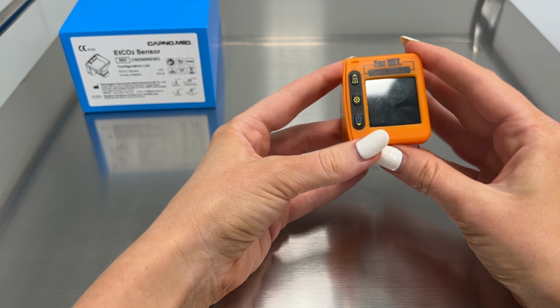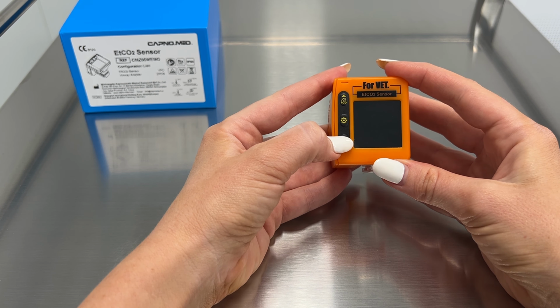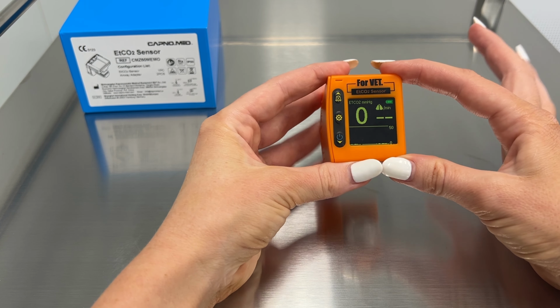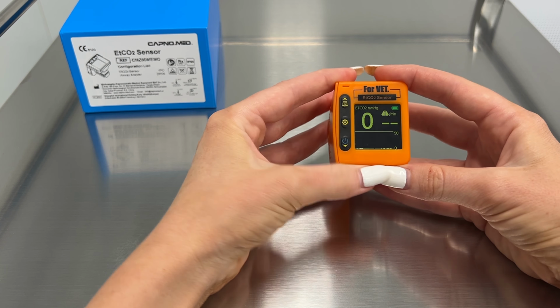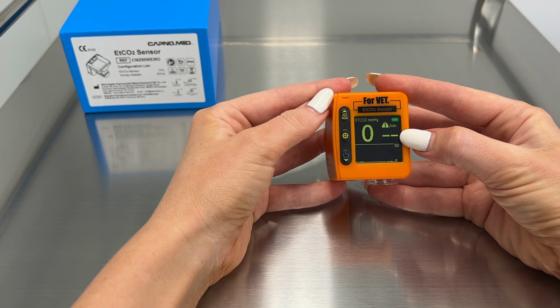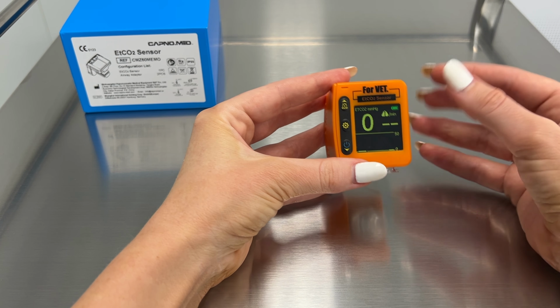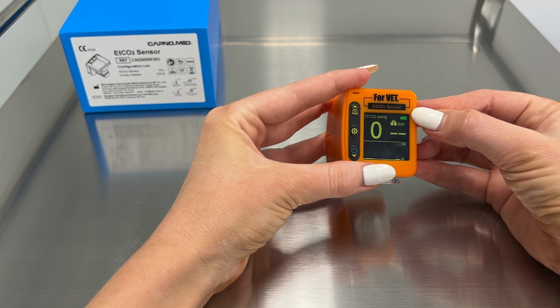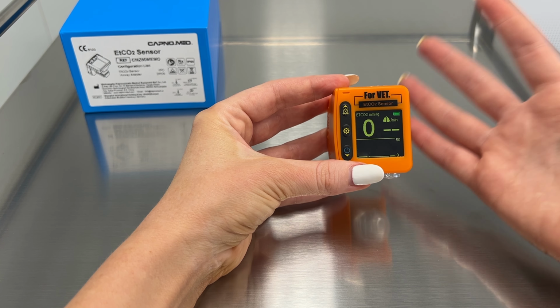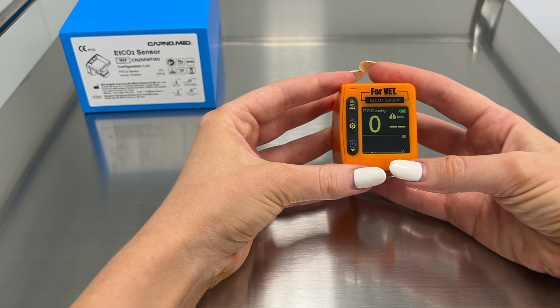Now we're going to turn the adapter on, pushing the on button, which is a little blue on symbol. Now this is the screen that displays. Here you've got end-tidal CO2, and over here you will have respiratory rate. And here you will see your waveform develop as well. Up in the right hand corner, it's got battery percentage, which is a good indication, making sure that that is nicely charged before you've got a big surgery to go ahead with.